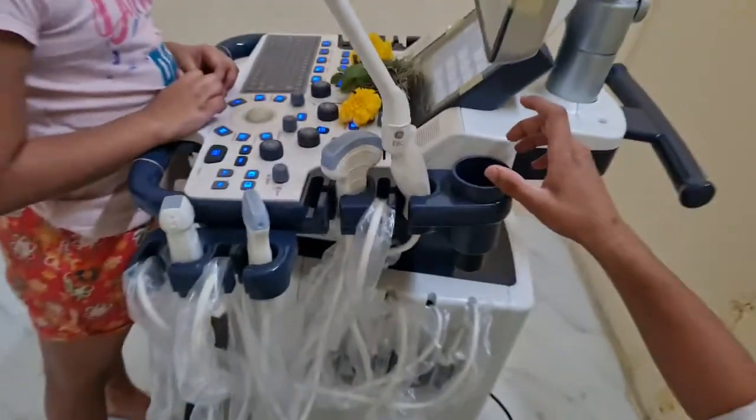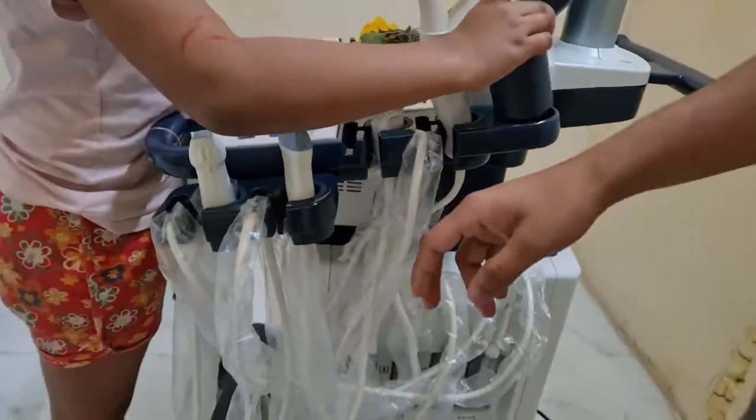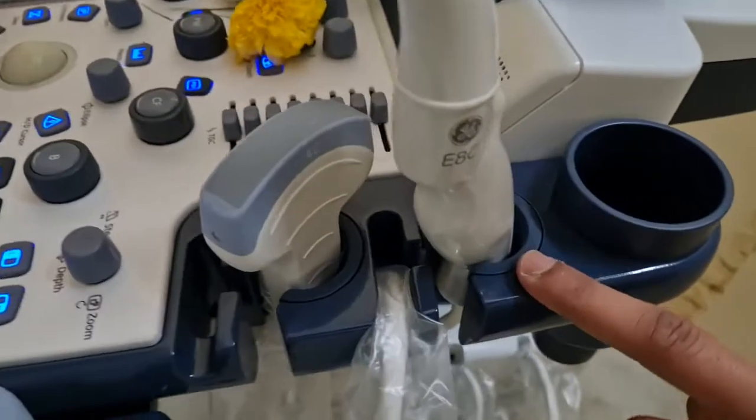This is used for the jelly holder. You can keep your jelly bottle in this. There are 4 slots on the right side of the machine, 1, 2, 3, 4, where you can keep your probes. Same as on the left side.